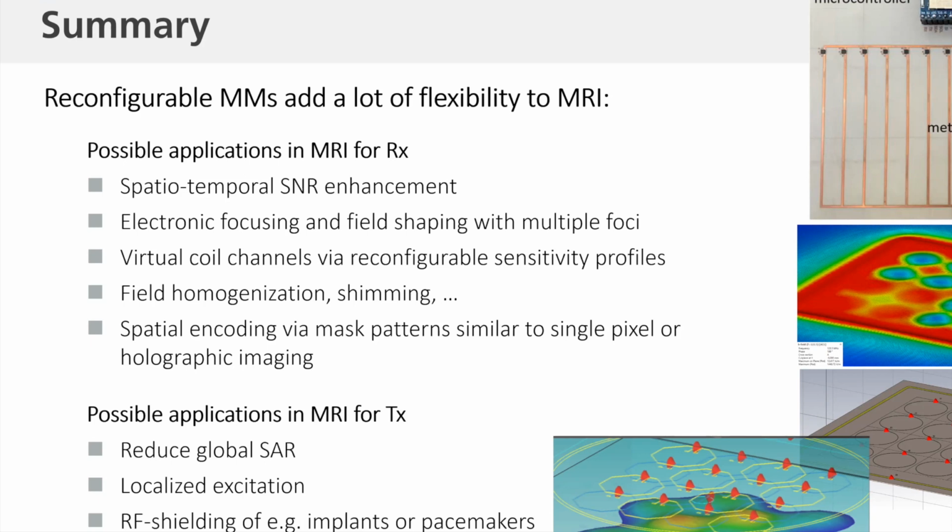And if you are not limited by switching gradients, but by switching your receive patterns, where the fields are more or less non-existent, so they are so small you can switch them much quicker. Yeah, I can see that, so you can be faster. But then again, I would think if you switch away your receive channels, you would lose the signal that you're not receiving at the time.